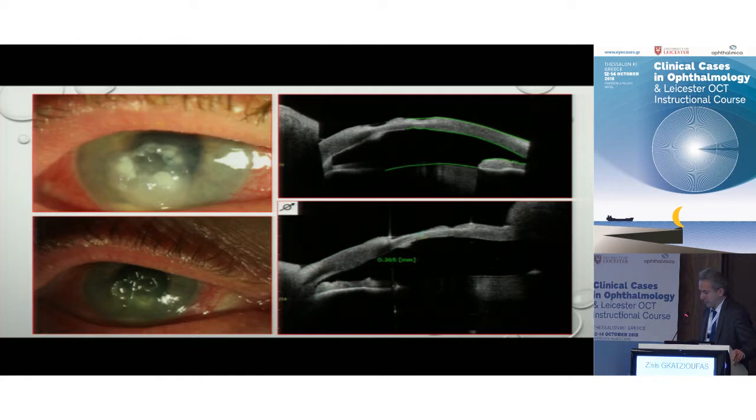After doing the appropriate treatment in these patients, in this case PACK-CXL, we can see that the retrocorneal plaque has decreased. So it's a good measure for evaluating the efficacy of our treatment approach. And this is the result after the PACK-CXL. I've shown these pictures before. But in any case, it is very useful to have the information regarding corneal thickness and the depth of the corneal ulcer.